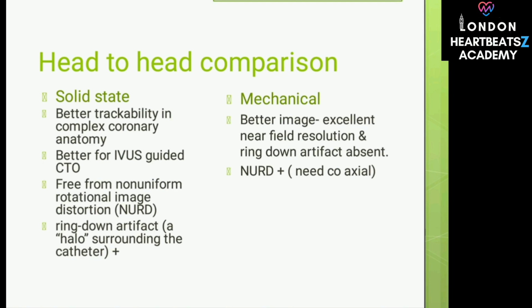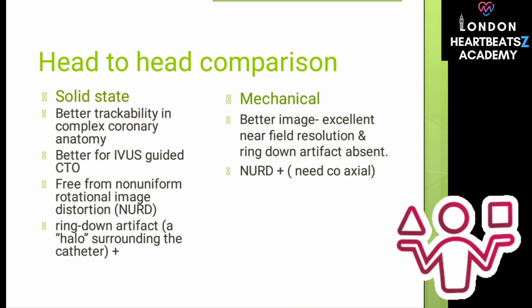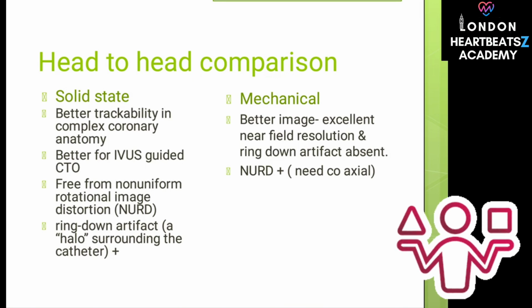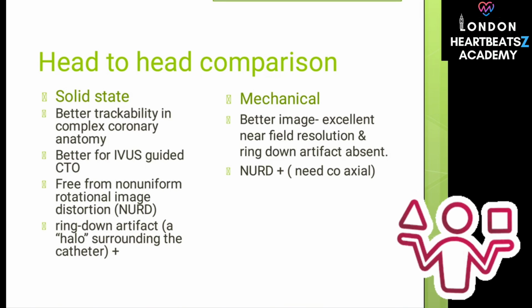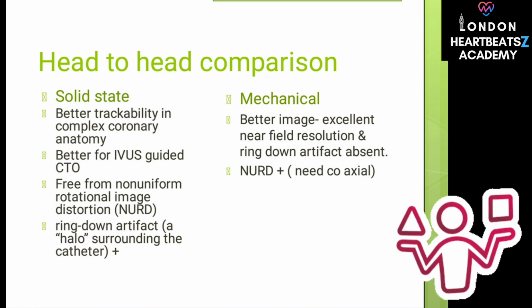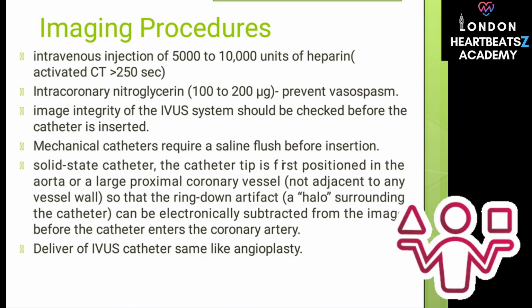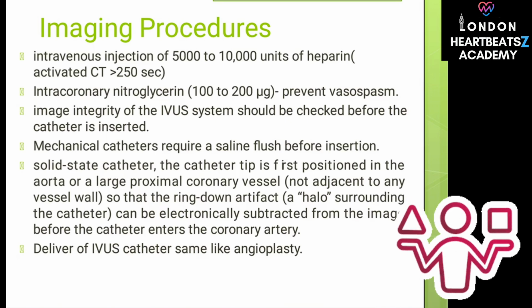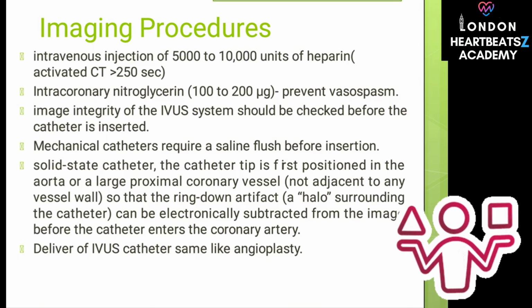Now, the mechanically rotating single transducer system sounds quite different. How does that one work? It is a different approach. In this design, instead of multiple fixed elements, there's just a single, very small ultrasound transducer element located at the very tip of the catheter. Just one. Just one. This single transducer is rapidly rotated, typically at a very high speed, around 1,800 revolutions per minute, inside a protective, clear sheath at the catheter tip. This rapid rotation is driven by a small motor unit that's located outside the patient's body, connected to the transducer by a long, flexible torque cable that runs the entire length of the catheter. These mechanical IVUS catheters are advanced over a standard guide wire, which runs alongside the imaging segment of the catheter, but importantly, it's outside the rotating sheath itself.